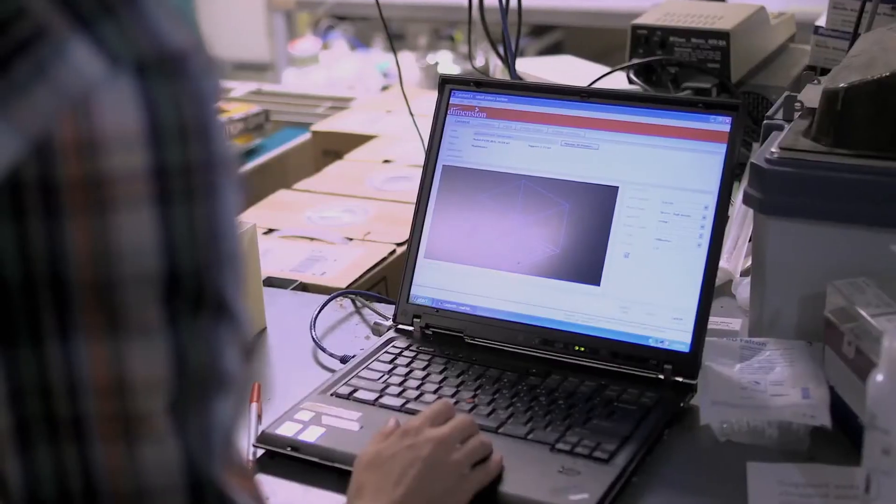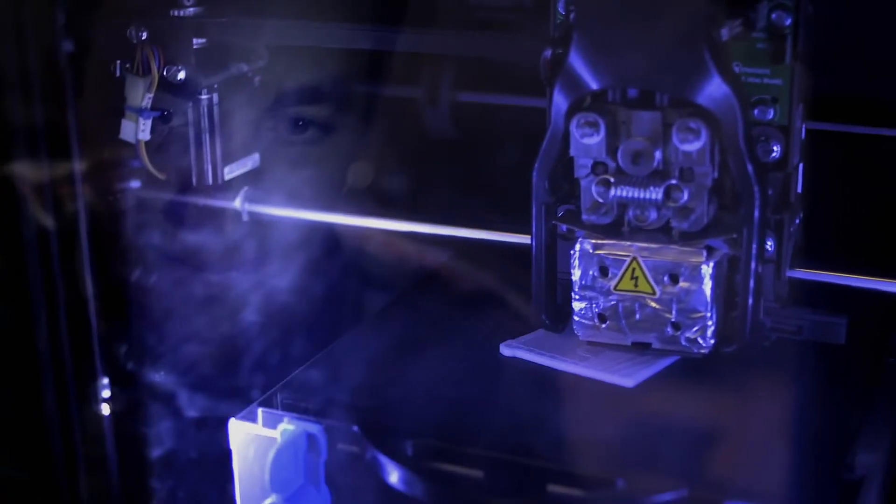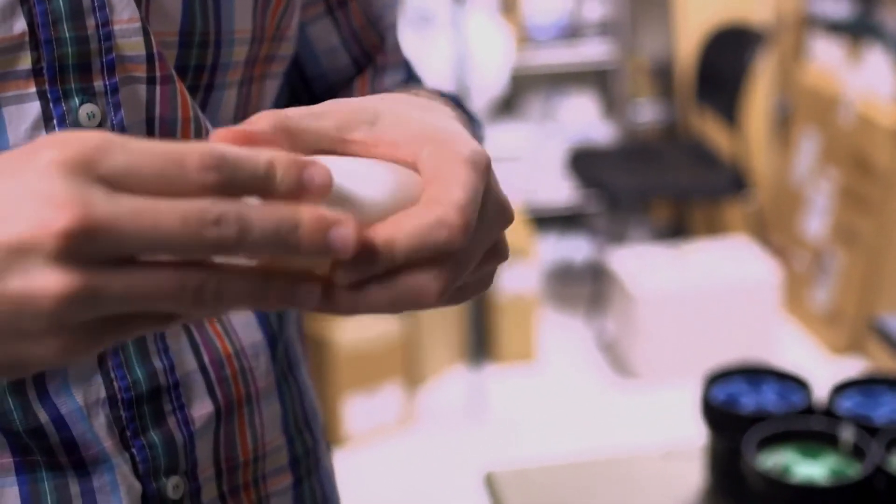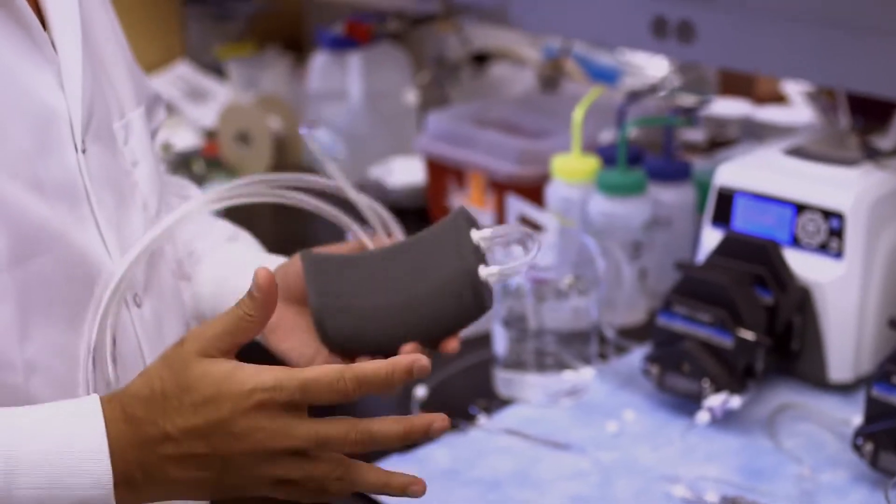3D printing is a big step in helping us prototype. We can design different versions so we can look at it. Part of engineering is you got to look and feel. It's the right size. Can a surgeon implant that? We're testing and optimizing each of those components individually to make them as best as they can be and then eventually bring them together.